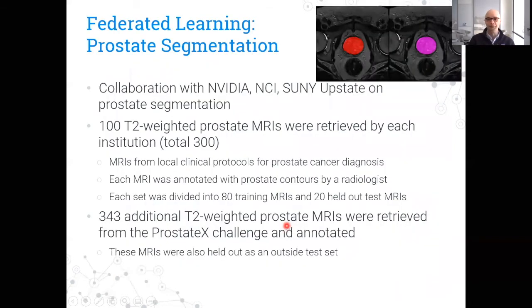So moving back to our deep learning work, we recently had a collaboration with NVIDIA, the National Cancer Institute, and SUNY Upstate in New York on prostate segmentation. And the goal of this collaboration was to study federated learning. And so prostate segmentation is a pretty straightforward problem. There are already good algorithms for it. I've shown an example here of a ground truth with a predicted region. You can see it's quite good.